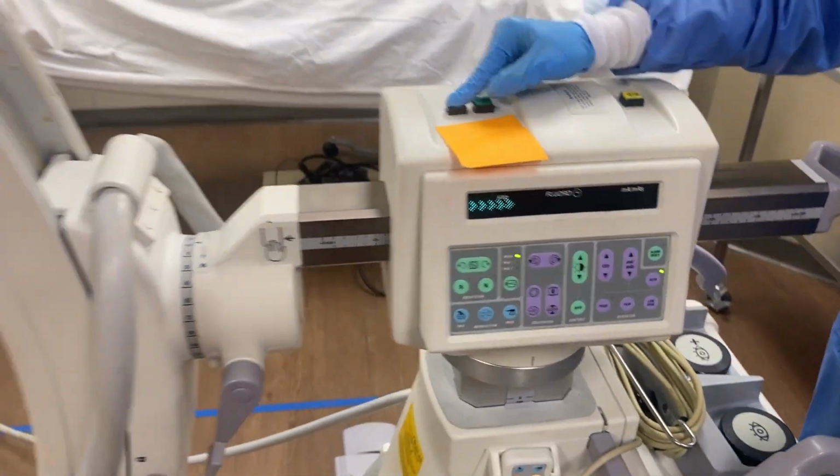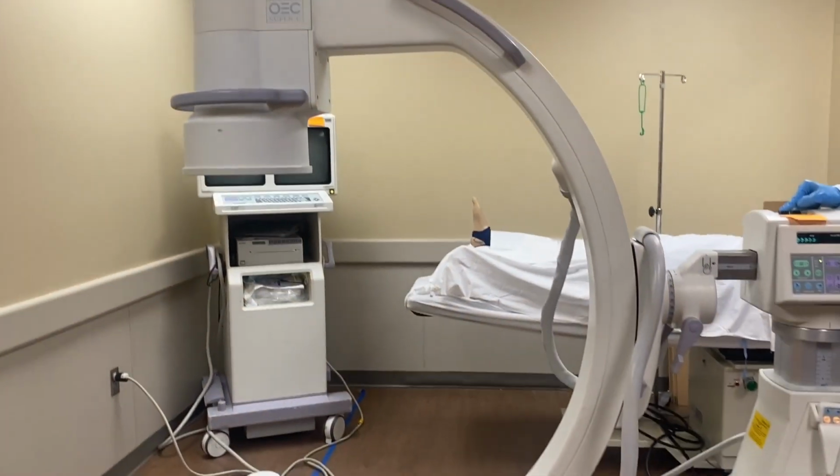Here is us showing the up and down buttons and how they control the height of our C-arm.